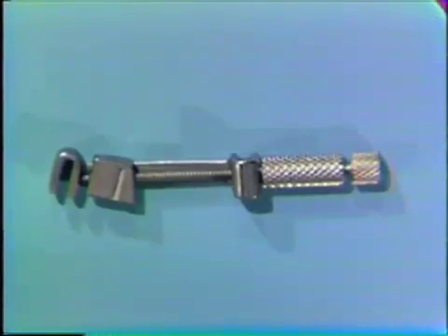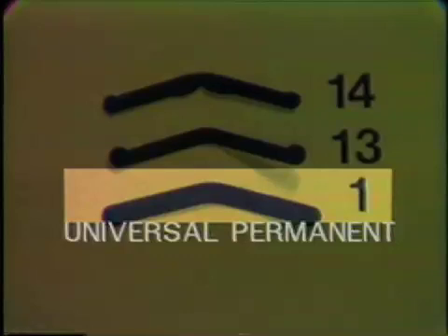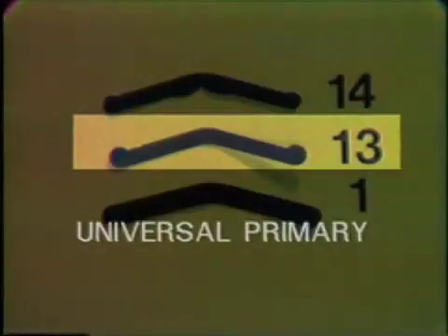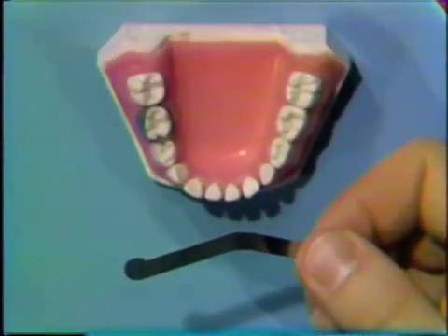The Toffelmire matrix retainer uses pre-formed Toffelmire matrix bands. The ones available in the clinic are the number 1, 13, and 14 bands. The number 1 band is the universal permanent tooth band. The number 13 band is the universal primary tooth band — it is lower than the number 1, and at either end of the band there are wider portions for retaining the band securely in the retainer. The number 14 band is designed like the number 13 except there are elongated portions in the middle for MO and DO preparations.